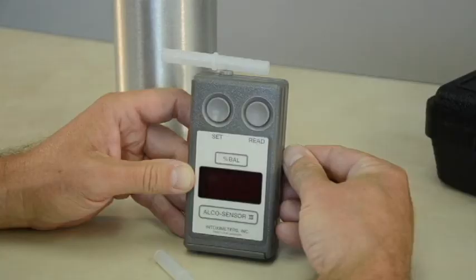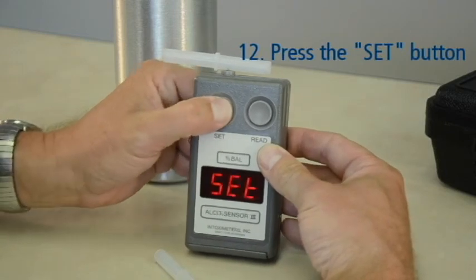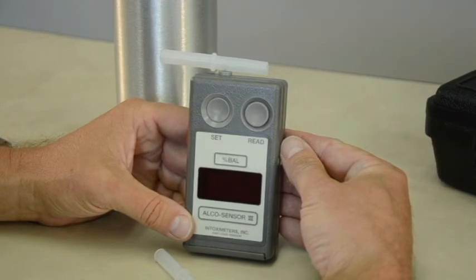Now record the accuracy check result in your logbook. When the device flashes Set, press the Set button. This ensures the fuel cell sampling chamber is in a closed position and the device is ready for the next test.